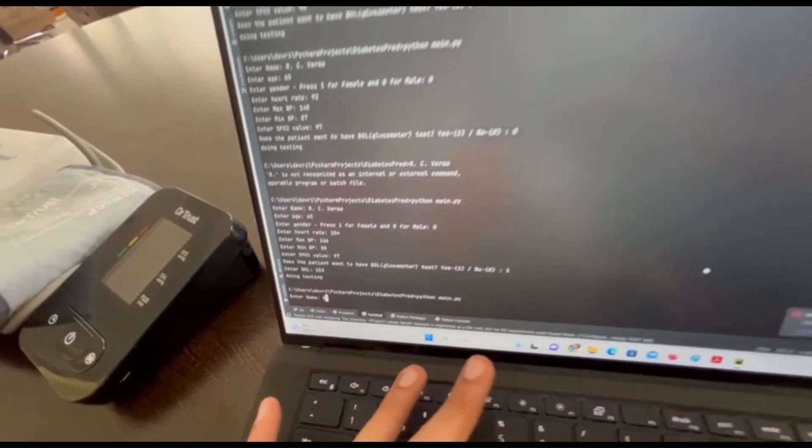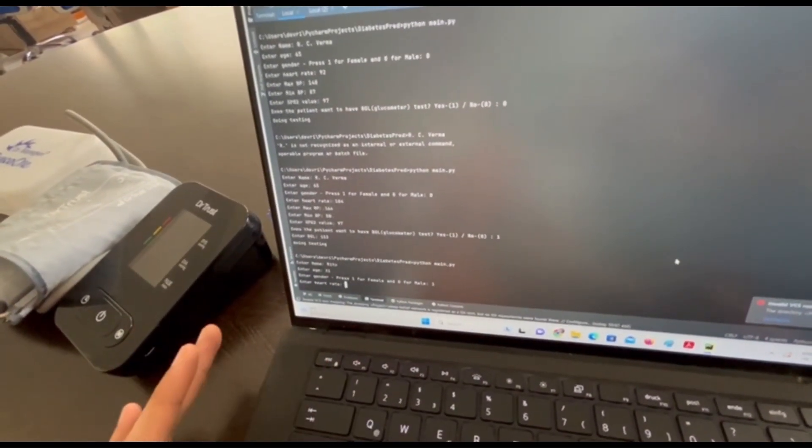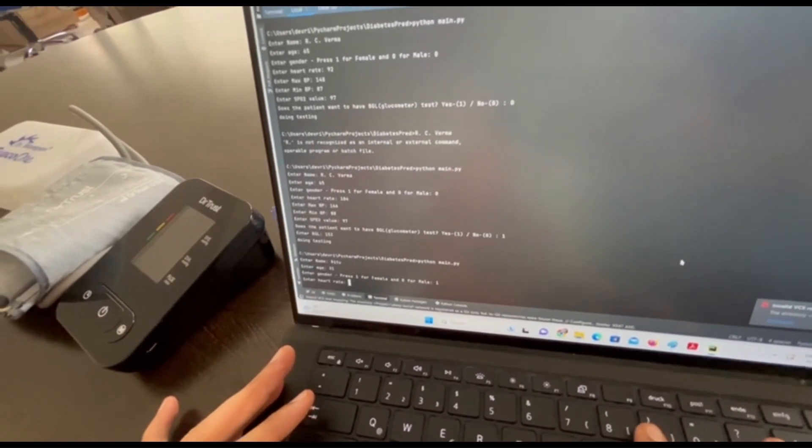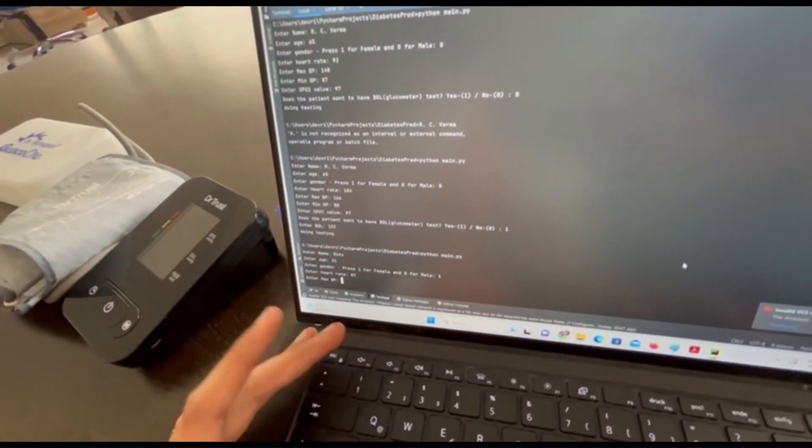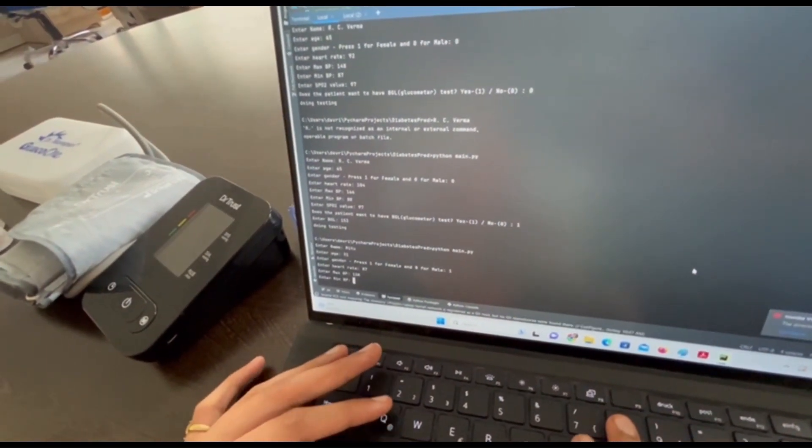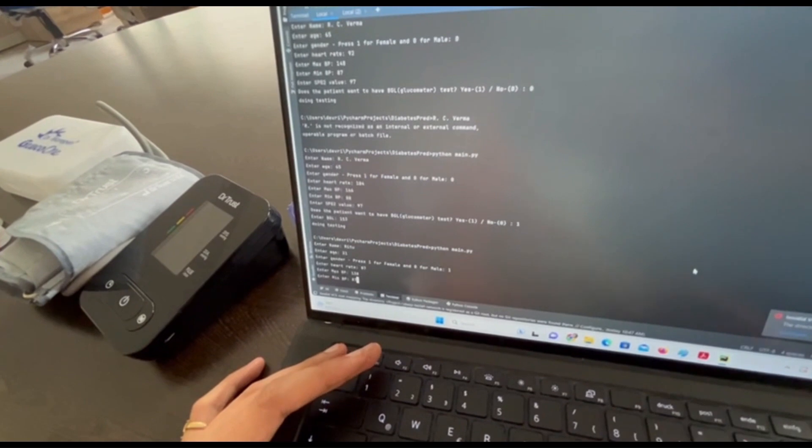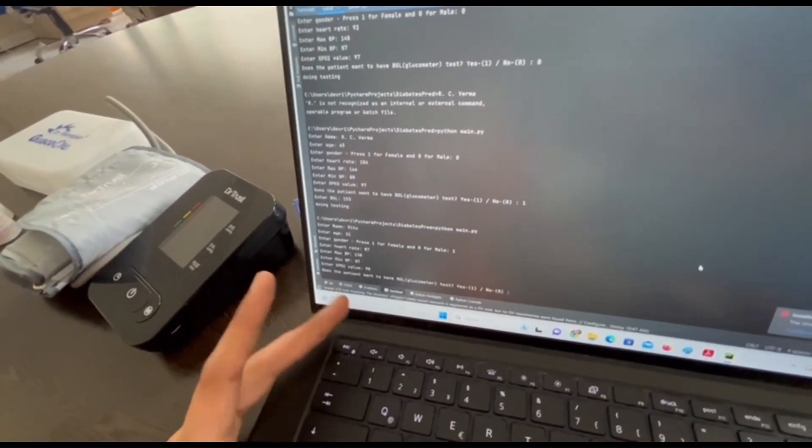I'll move the sensor's data file to the correct directory and run the script for diabetes detection. It's asking me to enter my name which is Ritu, age 31, gender female, heart rate 87, BP was 138 slash 86, SpO2 98.